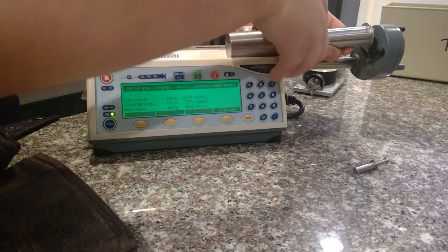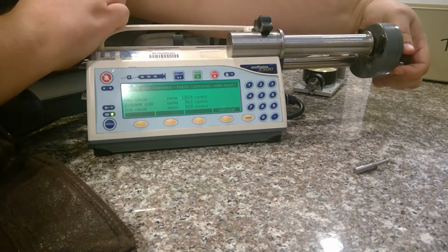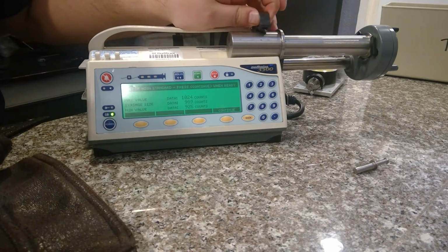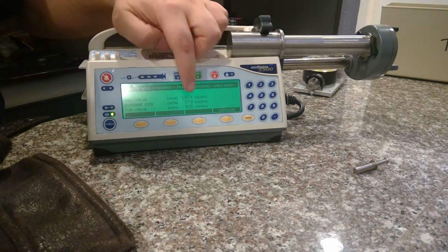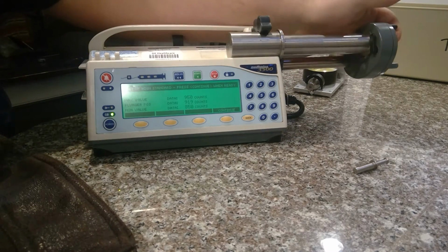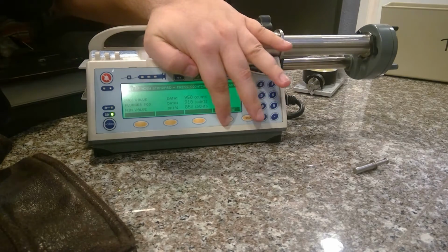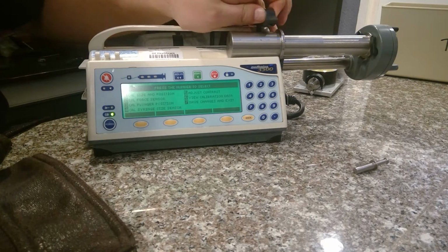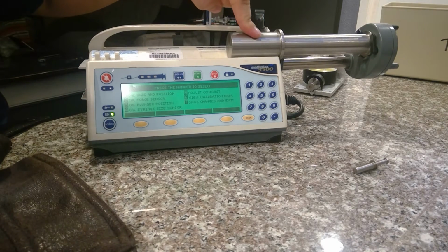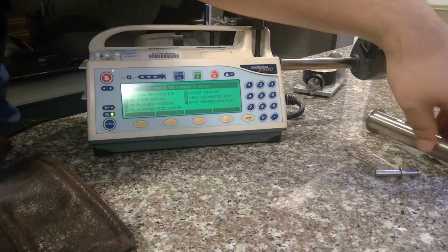We'll put this one in, and it'll tell you if it's not going to calibrate. So if I lift this up, you can see it go to 999, but 970, it's acceptable. So hit continue. Wiggle that. It's in between 850 and 950. That's good. Continue. And that's done. That's it. Small standard, continue, continue. Large standard or high standard, continue, continue. Just make sure that they're snug.